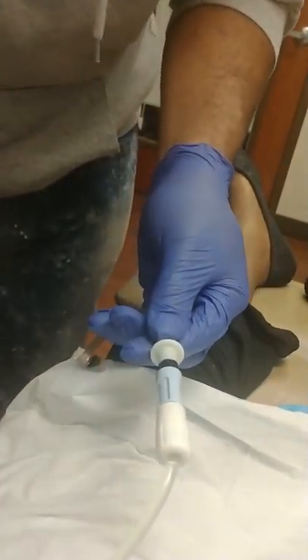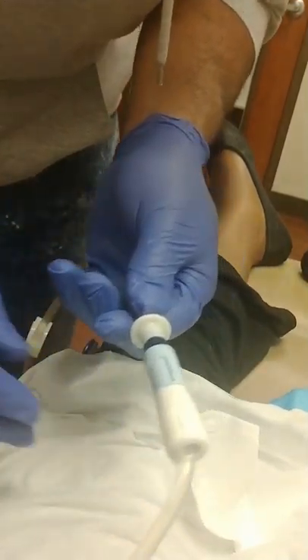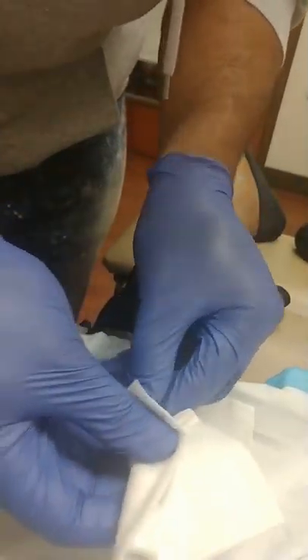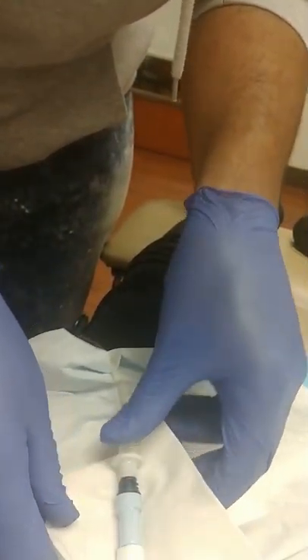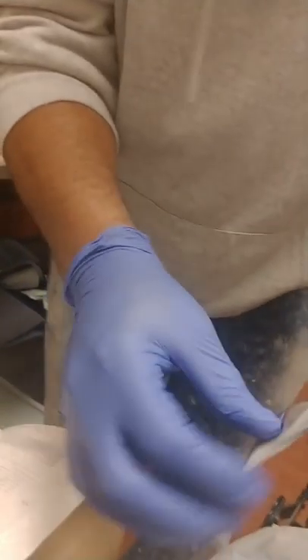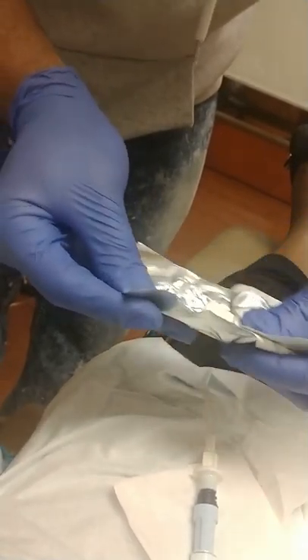Alright. Okay, that's been a minute. Right there. Then you dry. This is the cap for the catheter. Sit that over there, remember? Well, sit it right here. I just want to make it to where I can get to it when I'm done. All right.